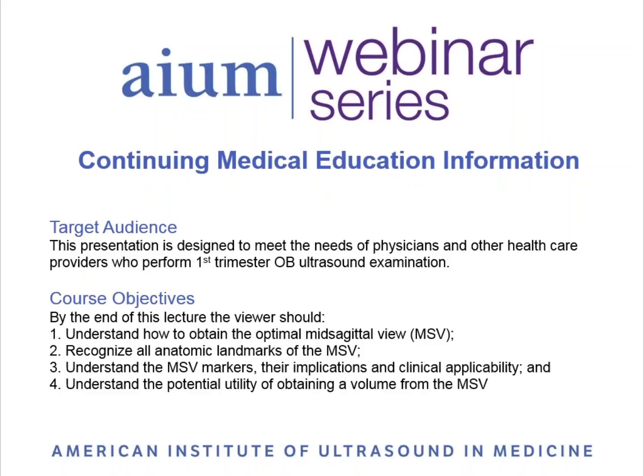By the conclusion of this webinar, participants should be able to understand how to obtain the optimal mid-sagittal view and recognize anatomic landmarks and markers. Viewers should also understand the potential utility of obtaining a volume from the mid-sagittal view.